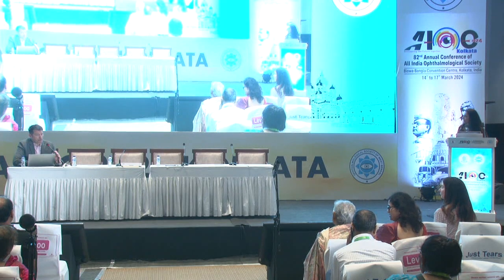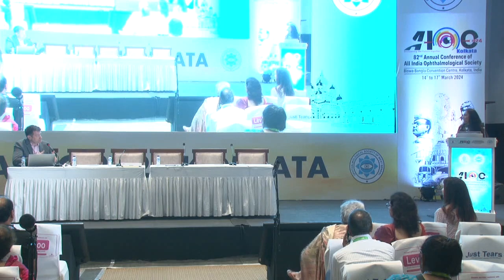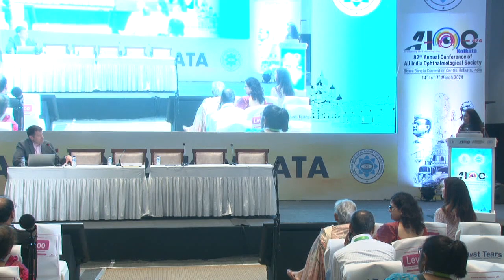And then the second question: you mentioned that torics are an option for patients with keratoconus who have a PK, let's say, because if the endothelium fails, you're going to be doing endothelial keratoplasty. But I think we've all seen these keratoconic patients who over decades tend to get that thinning at the inferior graft host junction and that anterior protrusion. So I've had the displeasure of doing a fair number of PKs on keratoconic patients because of that sort of ectasia at the inferior graft host junction. And these are folks, many of them with torics in, which then becomes problematic.